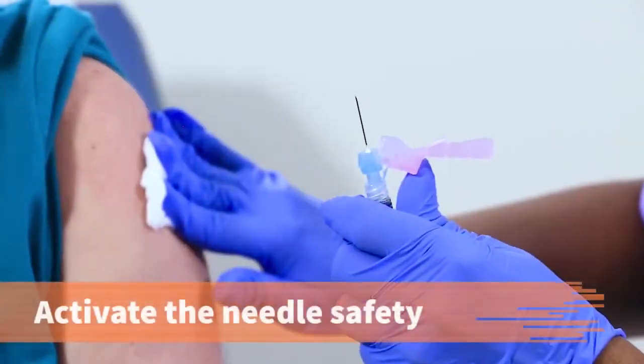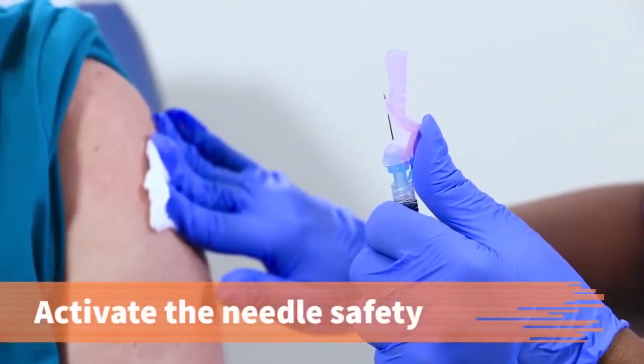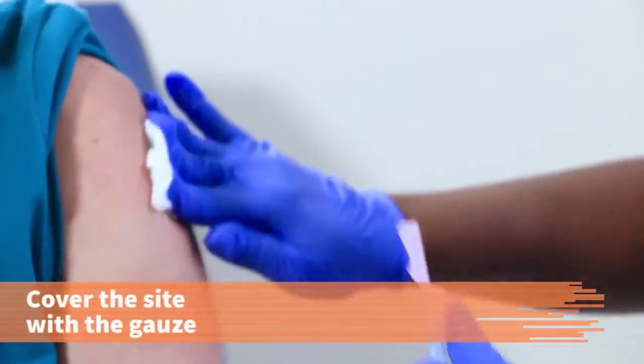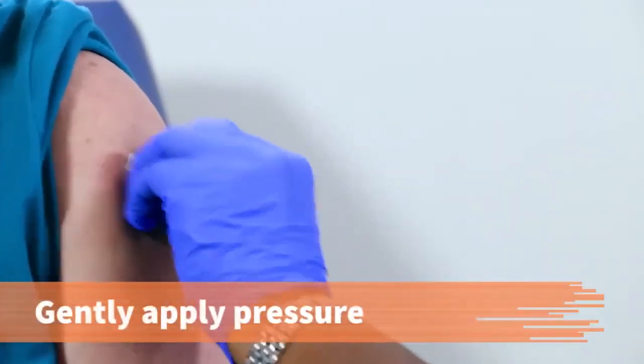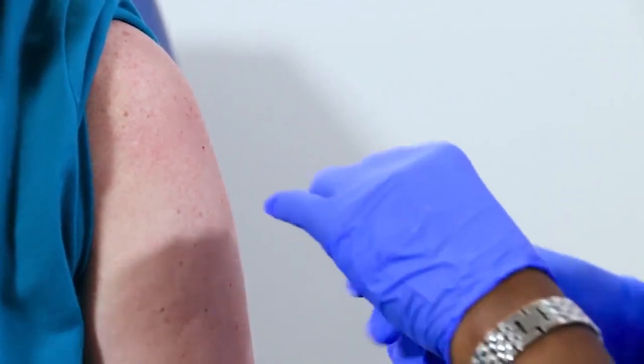Activate the needle safety device with one hand while the other hand covers the site with gauze. Gently apply pressure at the site to stop any bleeding. Apply a bandage if the patient requests it. Remember that some bandages may contain latex, which can be an allergen to some people. Some people may be allergic to the adhesive.